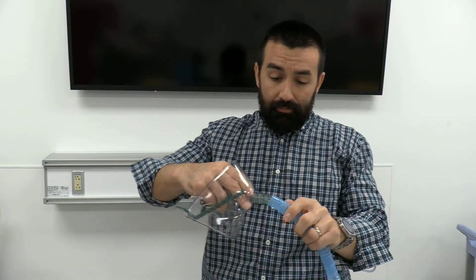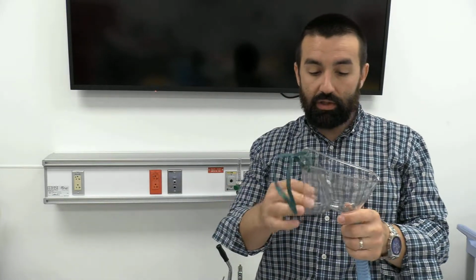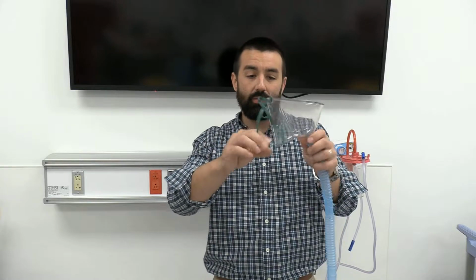The face tent, although it doesn't seem as effective because this is high flow, it's directing a ton of gas up right at that patient's nose and their mouth, okay? I've used this, once again, on a lot of cigarette smokers on oxygen, they get burned and melt a cannula on their face. I've used this on like croup kids and things like that as well.